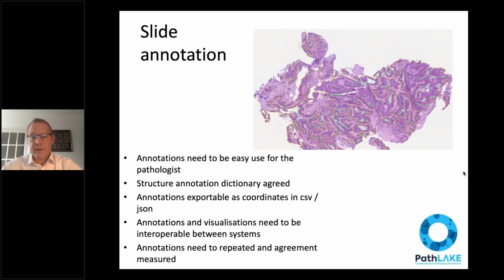The purpose, of course, of these annotations is to communicate the precise coordinates of the object of interest that's on the whole slide image to the pixel data that's then going to be analysed by the analytics computer engines. And this is done by means of enormous spreadsheets which produce CSV or JSON files of the particular coordinates which have been annotated by the pathologists as they go forward.